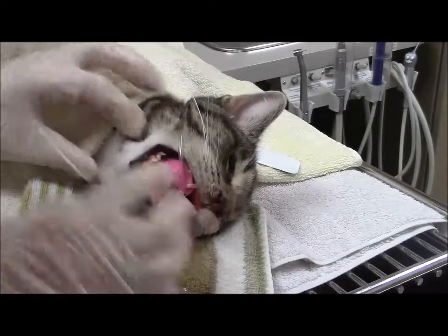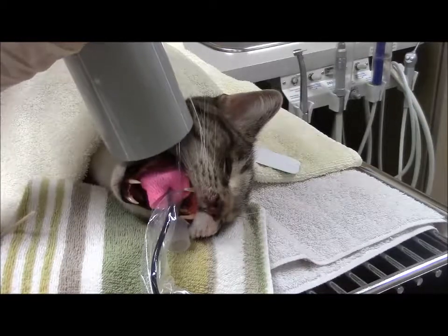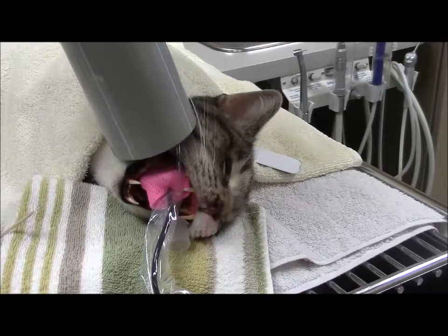So there's your sensor in place, and then for a parallel technique, you just take your cone and you direct it right at the sensor and take your x-ray. So you may have to do that parallel technique, you may not have to. It just depends on if you can get that sensor pushed back far enough.